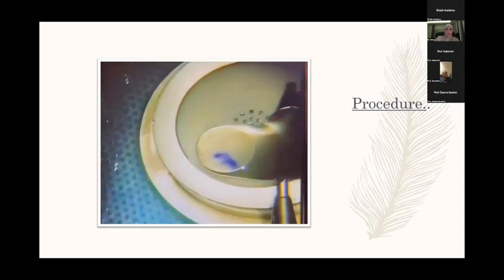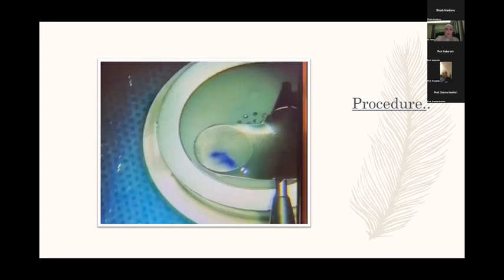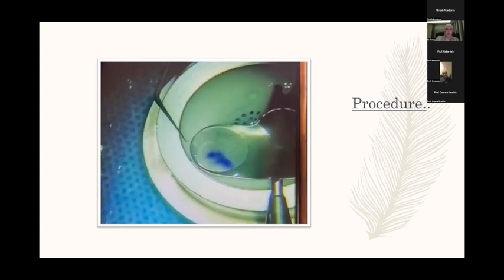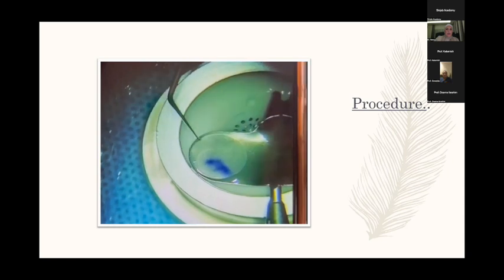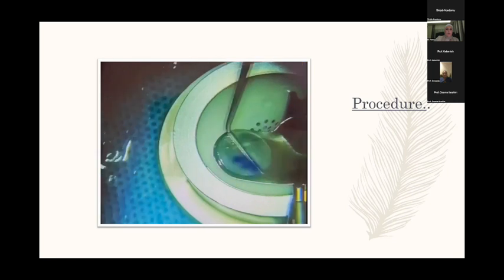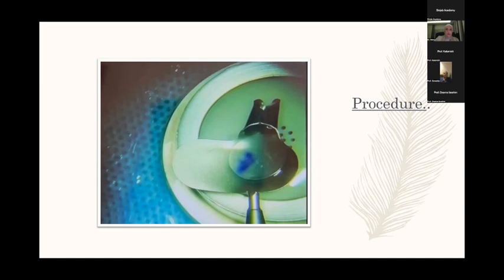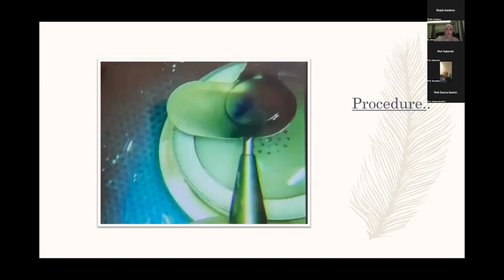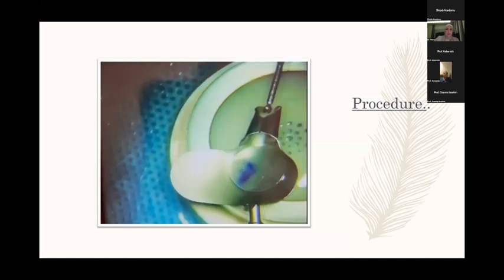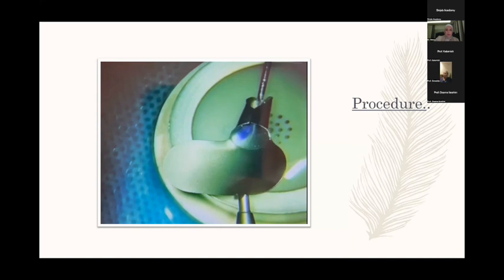As you see, I try to bring it to the lip of the, so this is the reverse Sinjab hook, and this is where I use it. There was a small tag here. I use it to bring it to the lip of the Busin glide or Busin spatula. And then I use my micro forceps to pull it to the lip of the glide.